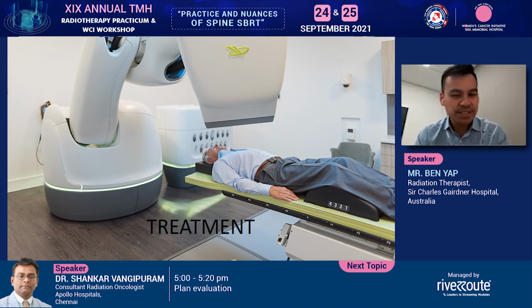For imaging frequency, it would really depend on the target site, the patient, and the confidence of the team in your spine tracking. For example, if you were treating a lumbar spine with the disease localized to the vertebral body, and it was away from organs at risk like bowel and from the spinal cord, I'd be happy with the imaging being spaced far, far apart, 90 seconds upwards. Totally fine with that. And remember, this is a clinic decision.